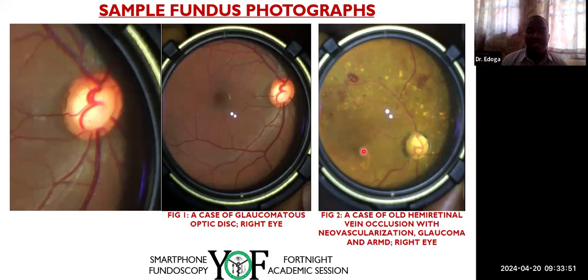If you want to minimize the reflection that will be on this lens, you have to turn off the light in the room. So it has to be done in a dark room. And later we'll show you how you know that you are getting to a sharp image by the distance between these Purkinje images.